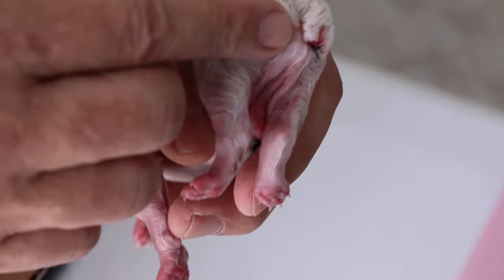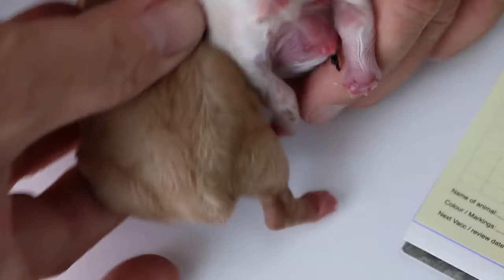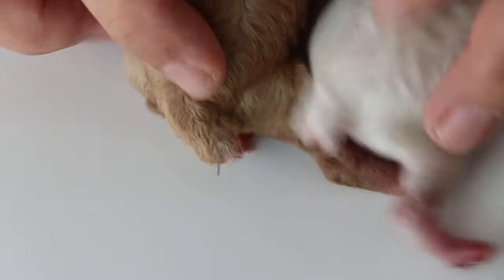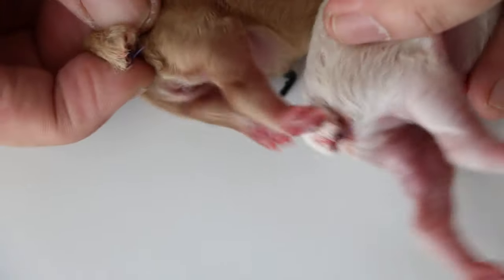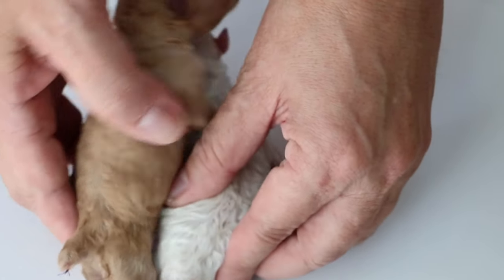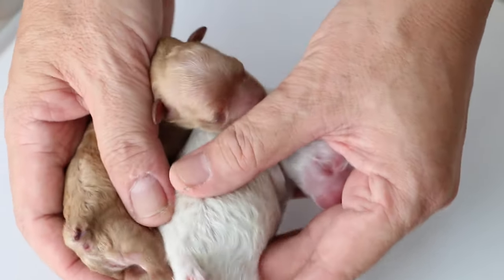This is the one-day-old poodle which had been tail-docked. The stitch is here, the cross stitch, and as you can see, there's no bleeding. Stitching is better than potassium permanganate. Potassium permanganate you can use as well, but it's not so clean. You can see that the length is one-quarter. When they grow up, they'll have a pom-pom at the end. This is a cross stitch, 3-0 absorbable. These poodles are one day old. The best time to do it is one day old, because when they're more than four days old, they're very thick and there's a lot of bleeding. So you can see there's no bleeding, and the poodle goes home.